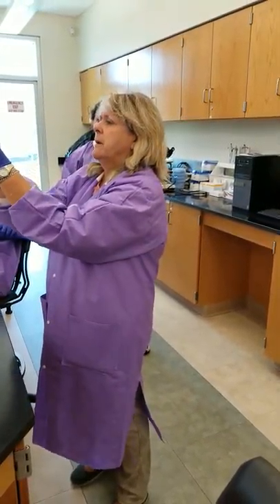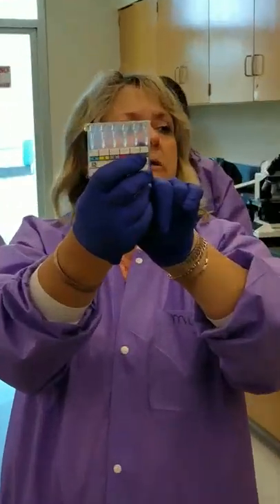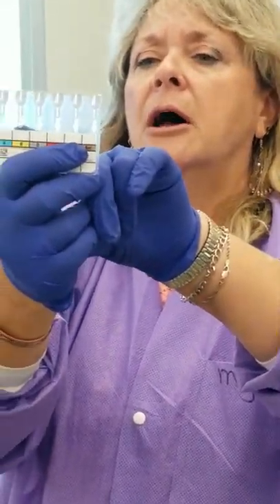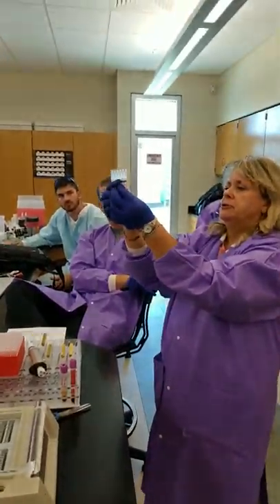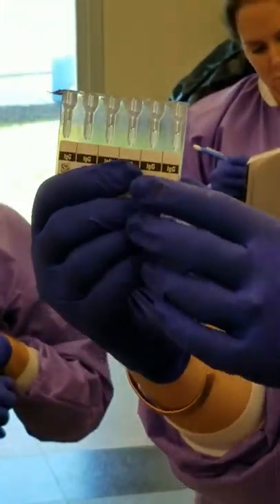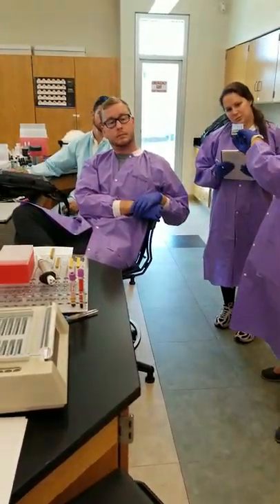There's a polyacrylamide gel in the bottom. If you can see the opaque area in the bottom, that's where the antigen and antibody get hung up once it reacts up in the polyacrylamide gel. It's kind of easier to see. This is an IgG card. And if you look, you can see the polyacrylamide gel at the bottom that's opaque, and across the top, there's a clear line.